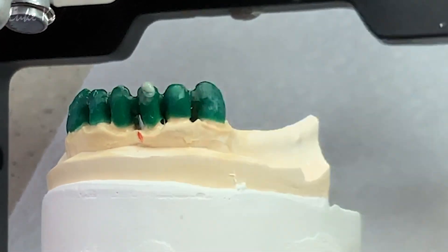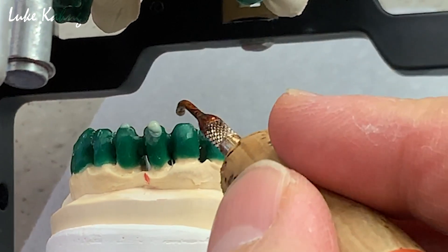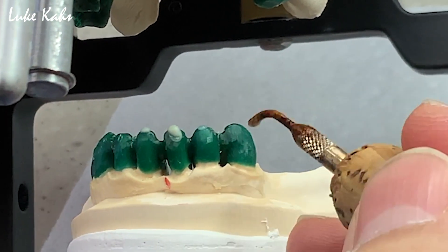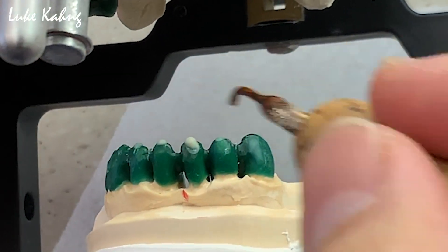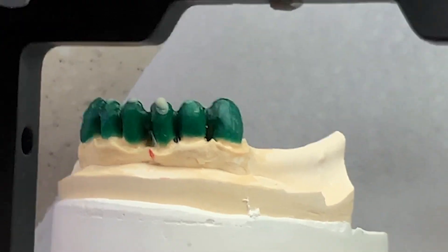Once you set up, same thing — same height. Like I said, too long, that's fine. Minimum as possible in that area. Everything is good here. Horizontal is good. Premolar is good.